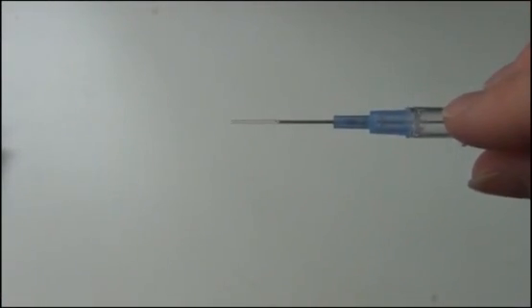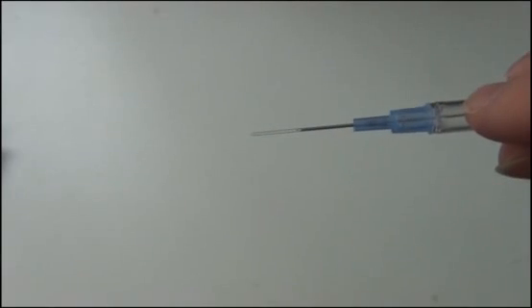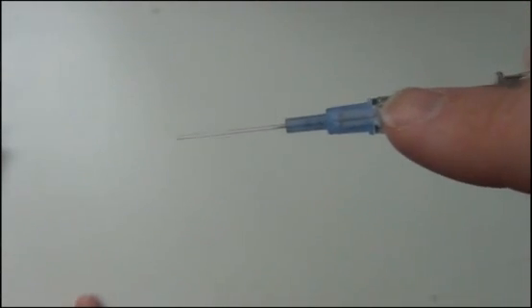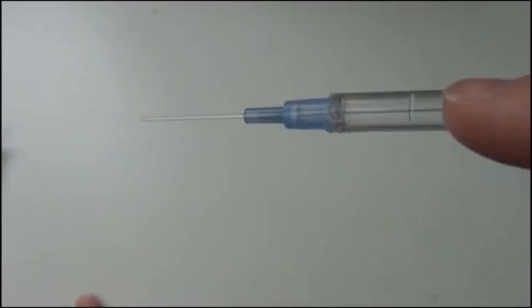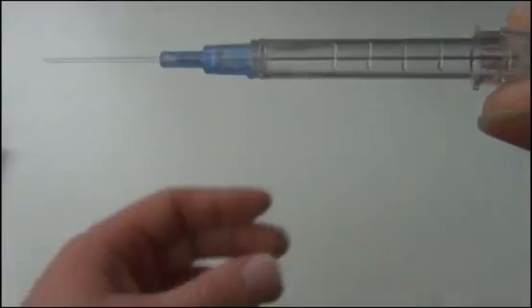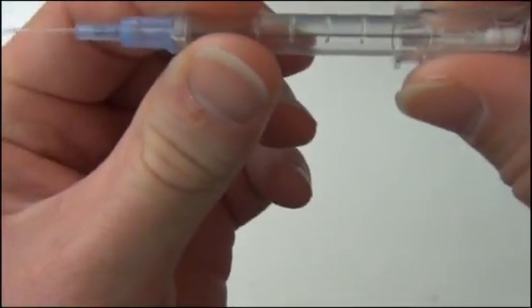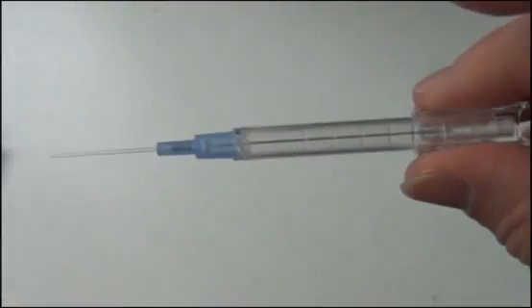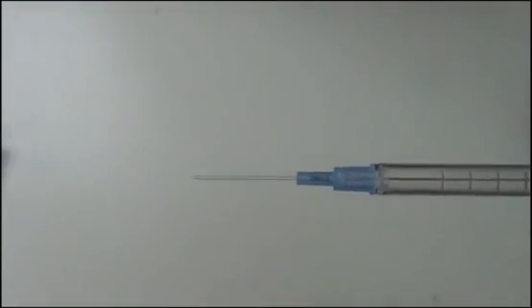Sometimes it's not going to advance really easily, but you may still be inside the vein. So you just advance this, and I want you to listen real closely, because as you advance, you know when you've advanced all the way, because the needle will actually retract into here, and you're completely in. You hear that little click? Once you've done that, you've retracted that needle completely, and I can't actually pull that back or anything anymore. So once you've done that, the first thing you want to do is you want to release that tourniquet off the patient. If you don't do that, you're continuing to pull this blood.